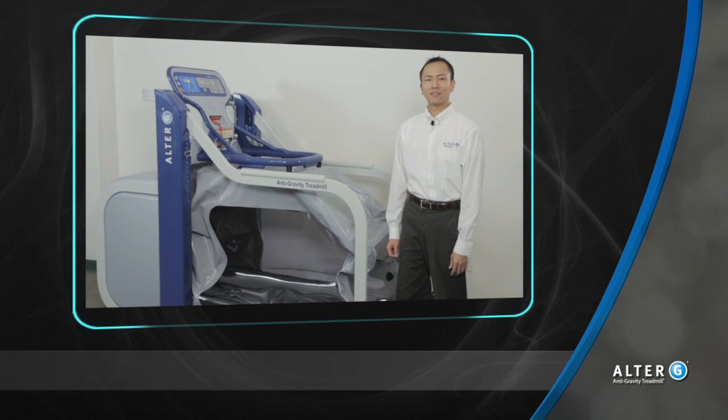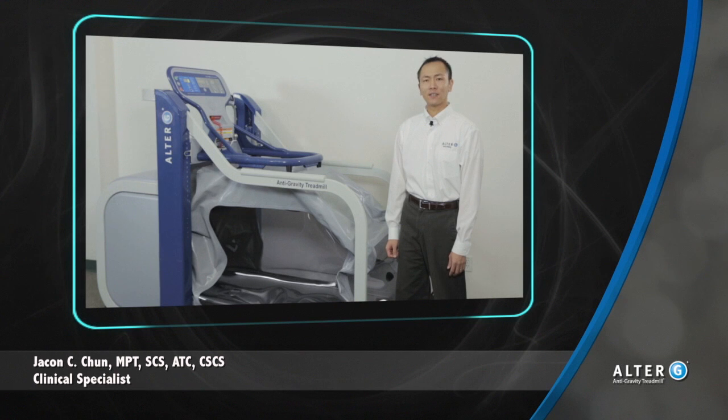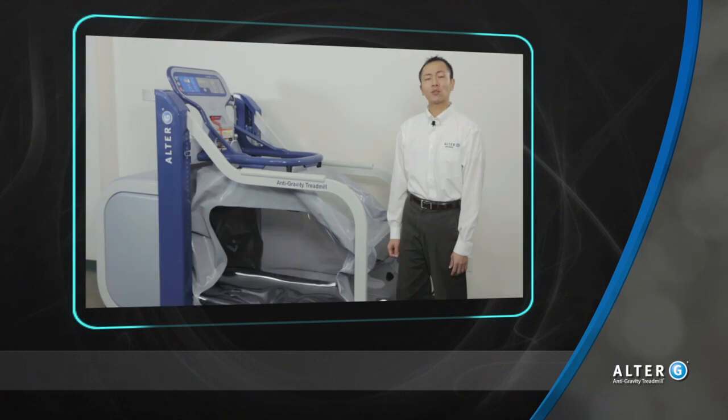Hi, my name is Jaikin and I'm a clinical specialist for Alter-G, makers of the anti-gravity treadmill. Today I want to share with you how Alter-G's differential air pressure technology can help you and your patients with gait training. Let me show you how it works.